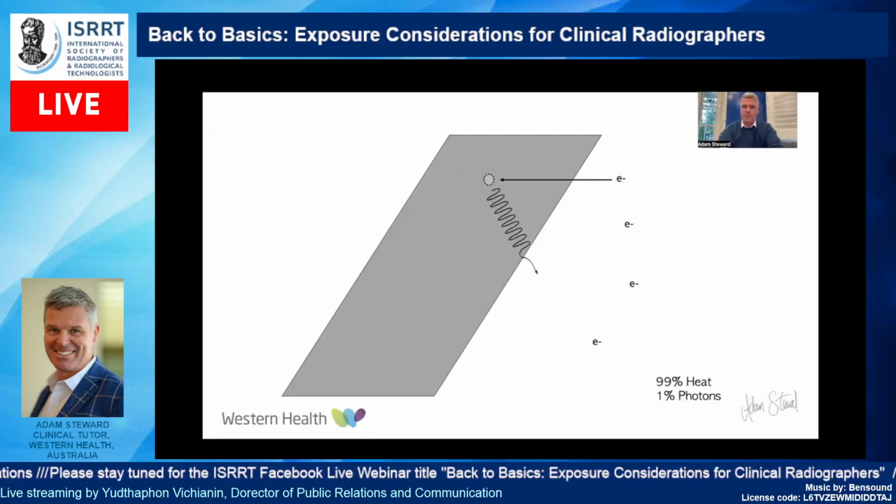All right, and that's how we produce X-rays. Now, this is the most simple version, and obviously we produce the X-ray, and in the most simplified way, all the energy is imparted into that X-ray, okay? And it's not inhibited in any way, and it's free to go, so it has the maximum energy that can be provided or imparted to it.